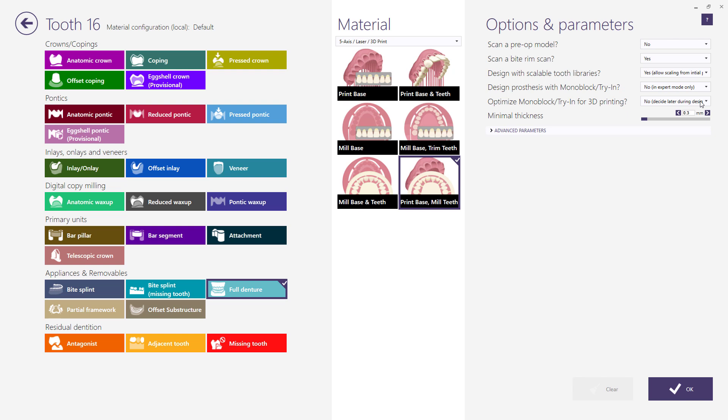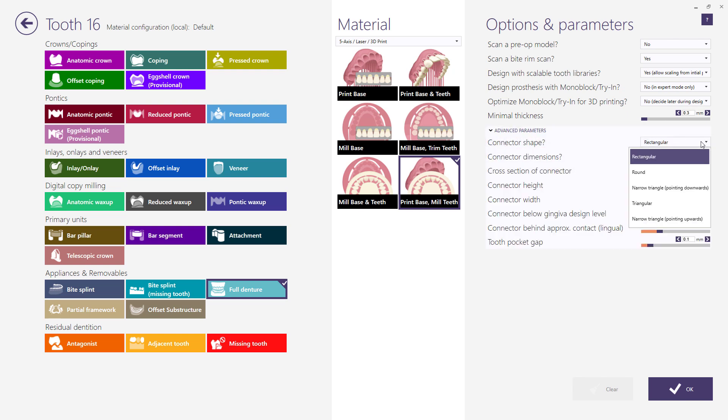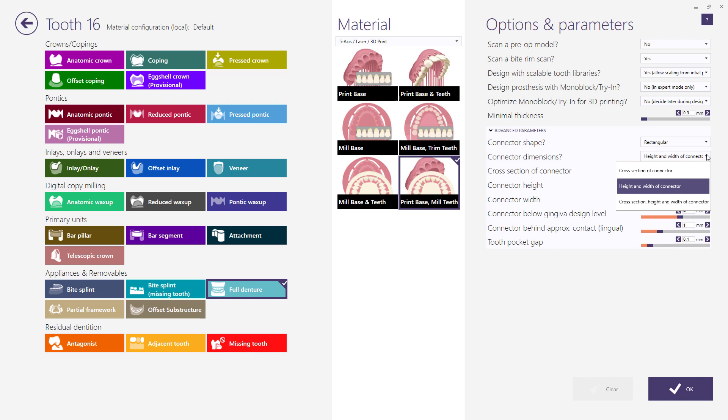Other parameters such as connectors shape and dimensions can be changed under advanced parameters. Connectors are available for material depending whether teeth will be milled or printed but not for stock denture teeth.